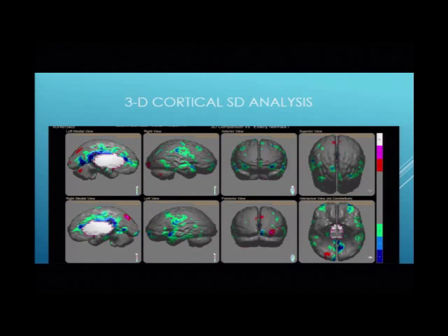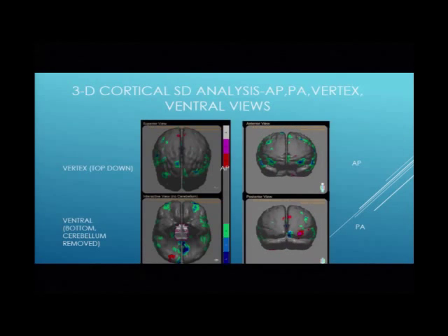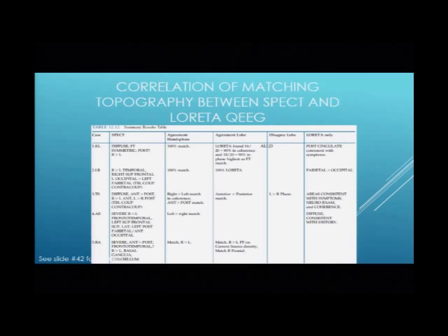In this area, he has this dark blue, like he has over here, all on the left side, and that's between -3 and approaching -4 deviations. He has it here on the front of his left temporal lobe and the tip of the frontal lobe, and a little bit on the right side too. So this actually confirms statistically what we saw on all the other pictures. This is just another view, a little bit blown up. On the back, he didn't have too much. This is probably an artifact here. Here's the front: blue, -3, -4, surrounded by green, which is -2. So clearly abnormal.